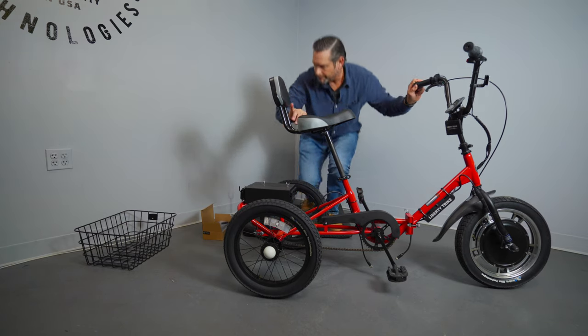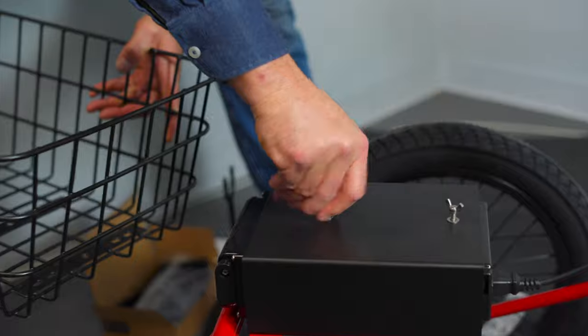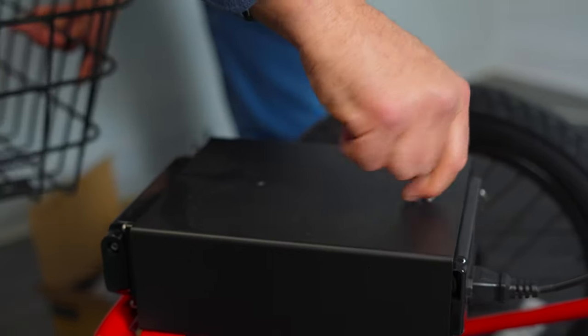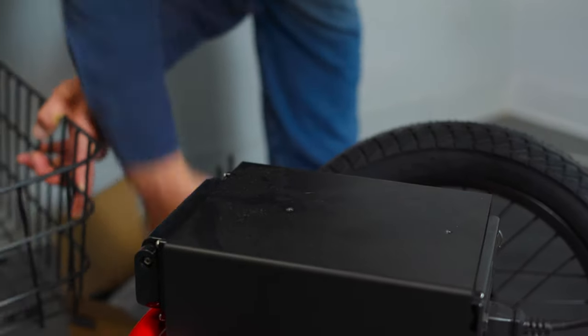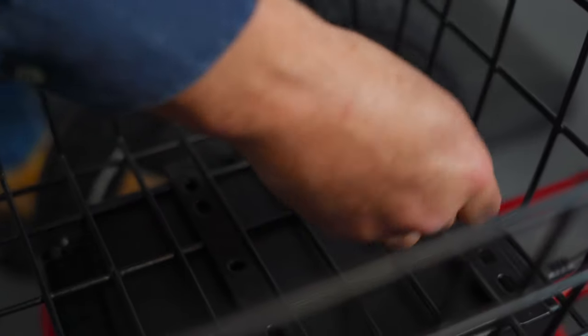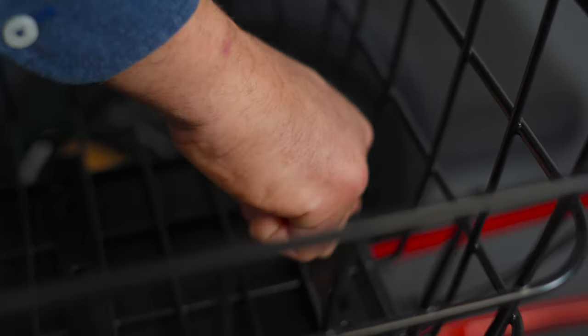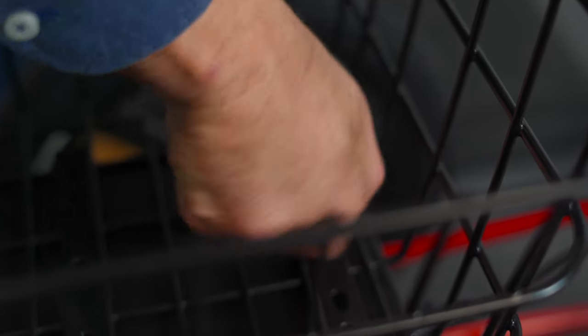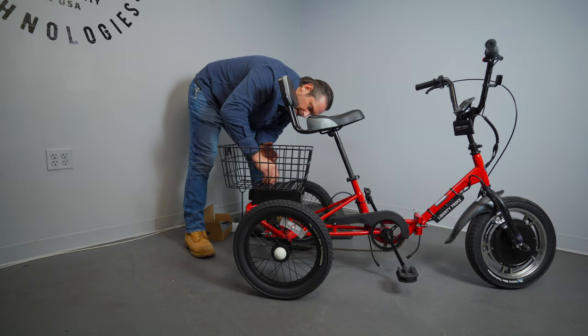Next, take your basket. The basket goes on in the back and you have a couple of wing nuts and washers — remove those counterclockwise. Once you remove those, lay the basket on top and find those threaded holes underneath. Line that up, then take a wing nut and a washer, carefully find the threading, and turn clockwise to tighten. Do that with both. Hand tight — you don't need to overdo it — and that should secure your basket.